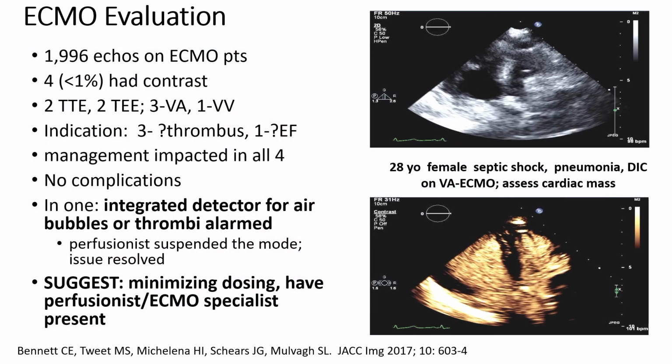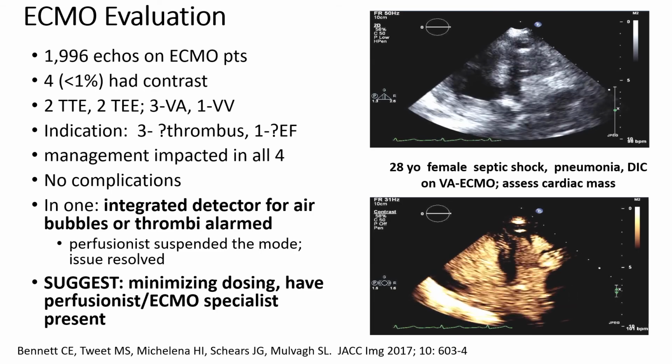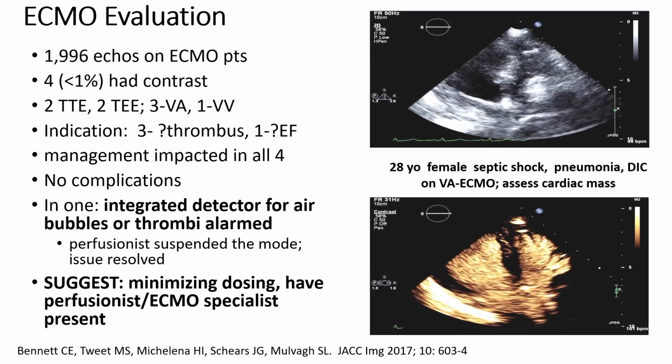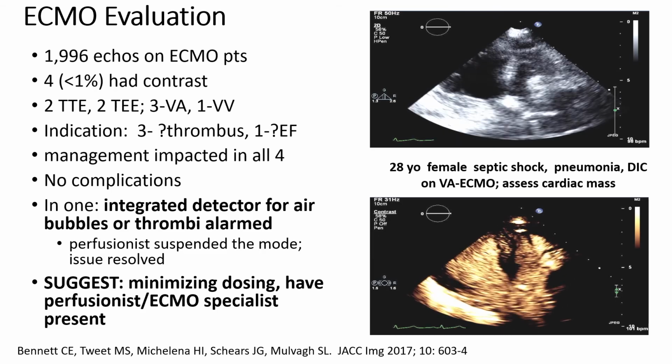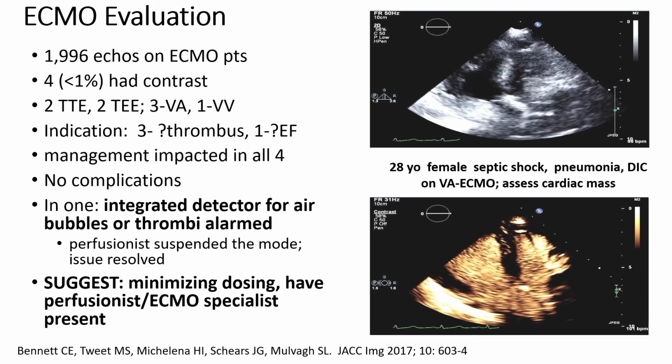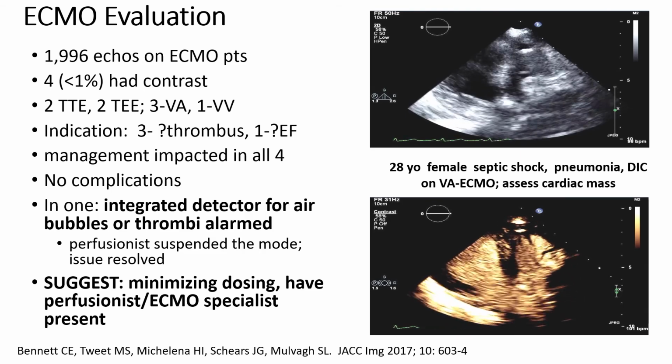We also looked at our Mayo experience several years ago regarding ECMO, and although contrast was used infrequently, it was helpful and safe, with the proviso that a perfusionist must be available at the time of the study in the event that the air detector alarms, which can occur due to the presence of the microbubbles.